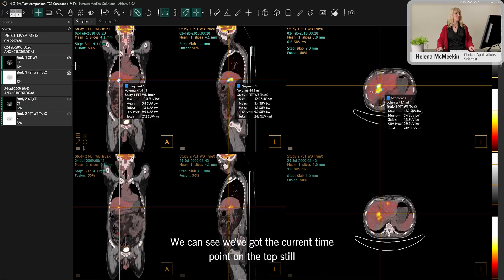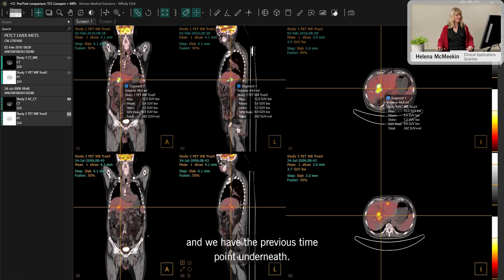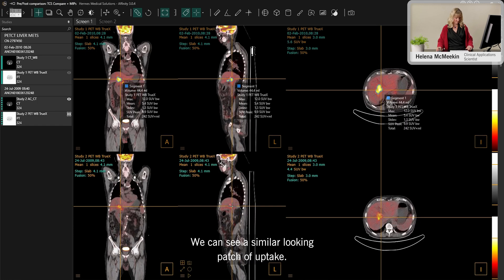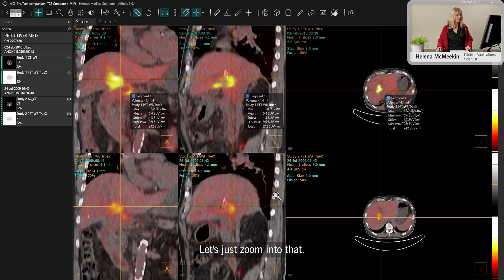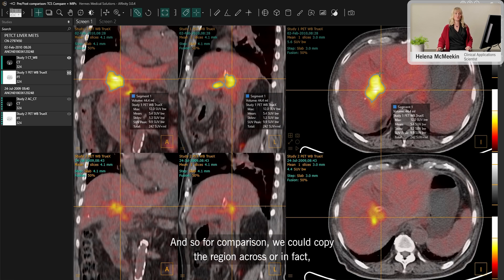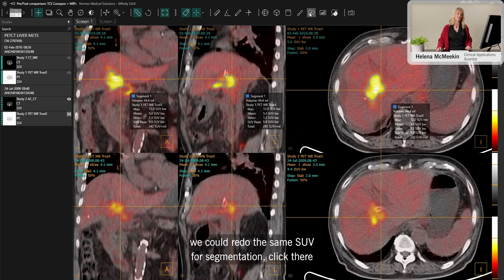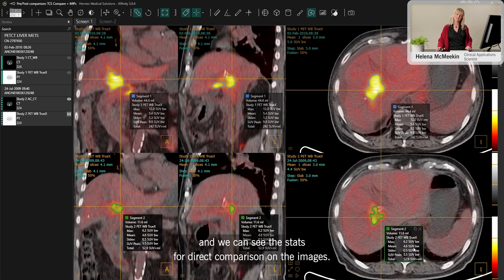Moving on to a comparison view — the current time point is on the top and the previous time point is underneath. We can zoom in on a similar-looking patch of uptake, and for comparison we could either copy the region across or redo the same SUV segmentation click there, so we can see the stats for direct comparison on the images.